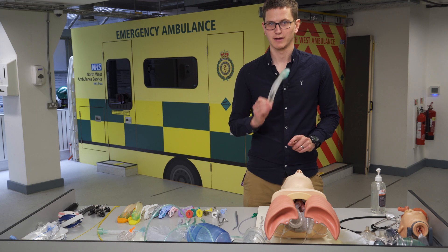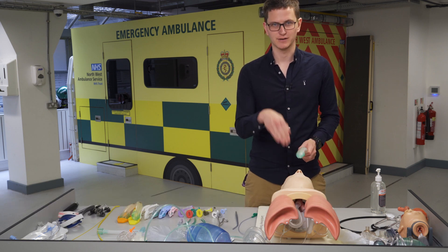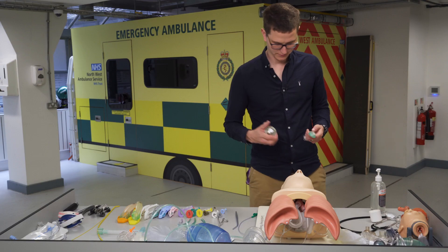A patient can still aspirate through an iGel. The LMA is a different kind of supraglottic device — it's a laryngeal mask that fits over the larynx. These mannequins need a bit of lubrication, so we normally use KY jelly.